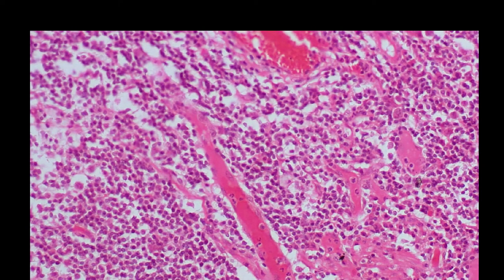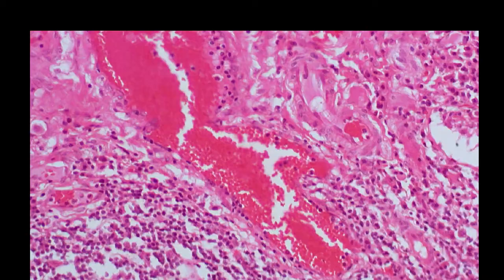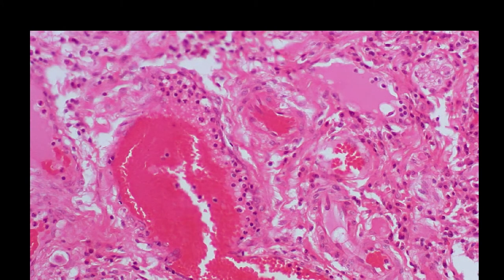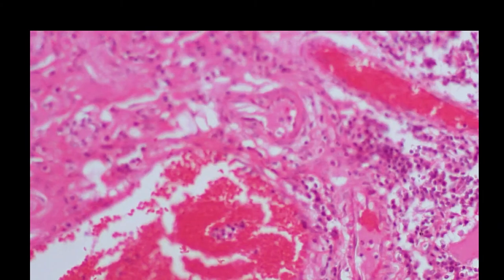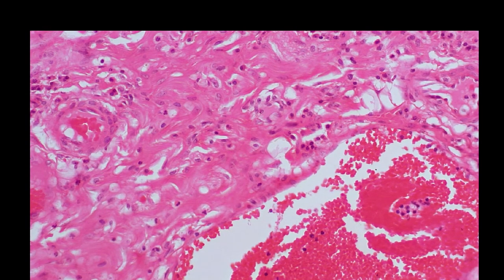If we track down into the depths of the ulcer there, you can see that it's the start of granulation tissue. And so notice these pink pale areas, they are collagenous areas, so collagen's been laid down by fibroblasts. There's a lot of engorged blood vessels here again. They're busy providing the oxygen and nutrients to this reparative process.